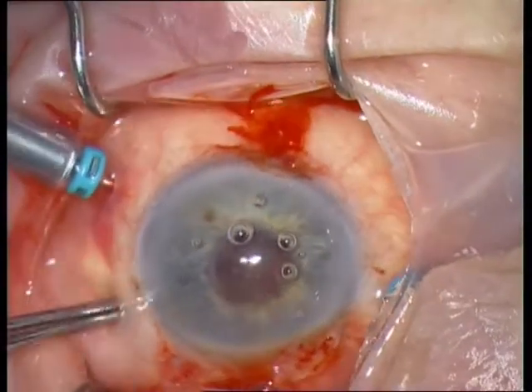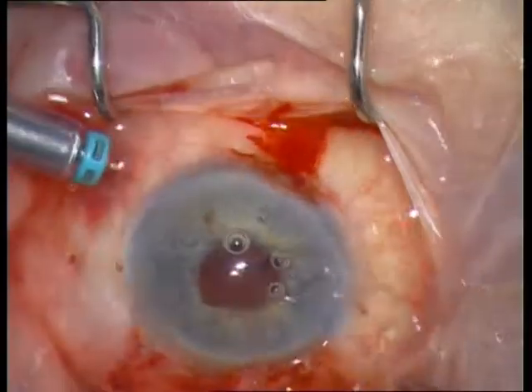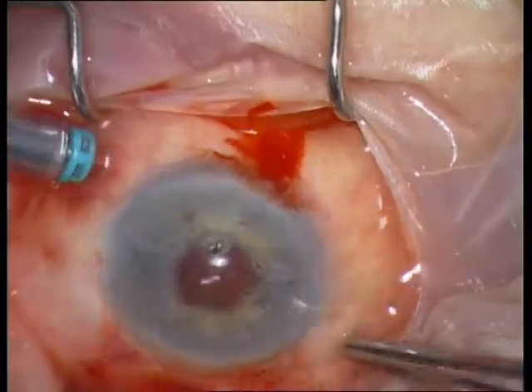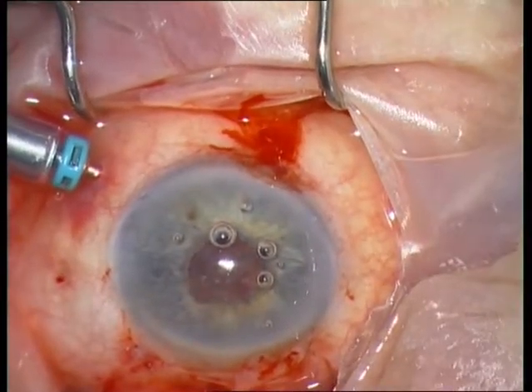Remove the trocars — first the two instrument trocars, and of course at the end the infusion trocar, so that you maintain infusion on the eye as long as possible.